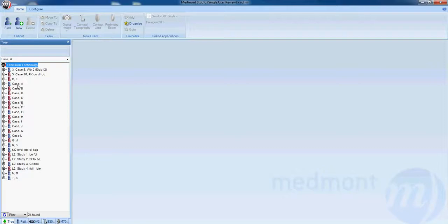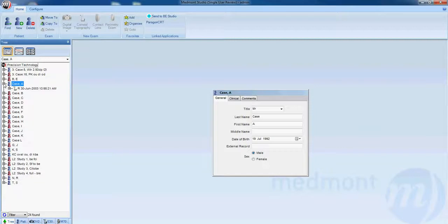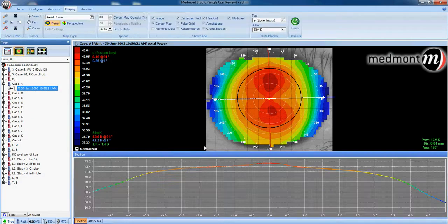Under patient name case, initial A, we can click on that patient name and bring up the main patient window. We also note that there is a plus sign next to the patient name, which indicates that there must be information inside that file. You can open up the patient file by clicking once on the plus sign or double clicking on the patient name. In opening up the file, we can see that there is one right topography inside that file. If you click on that topography, it will be dropped on the main active window.